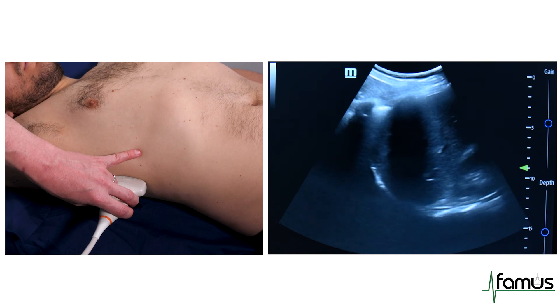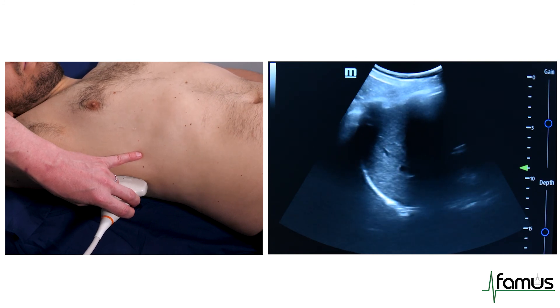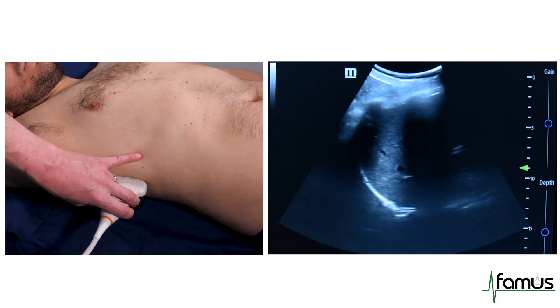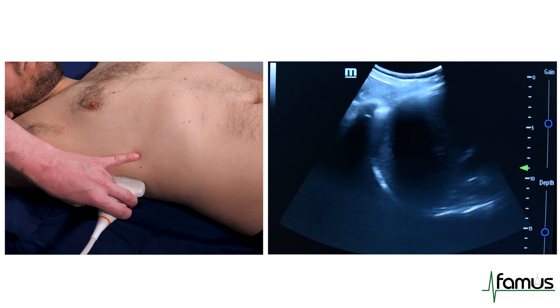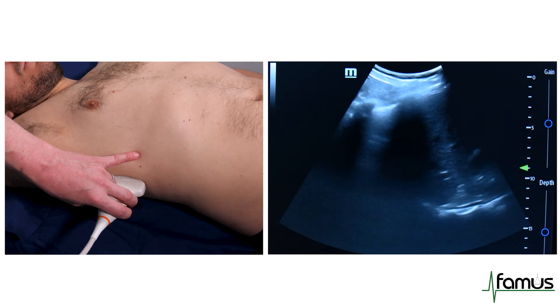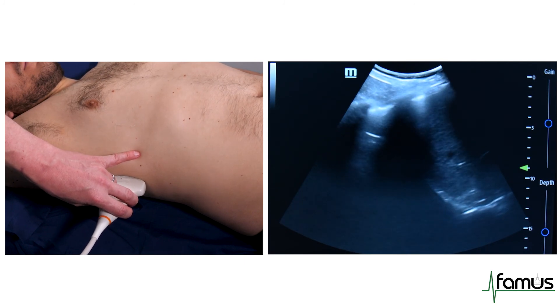Finally, we can see a demonstration of the mirror artefact here, which is generated from the base of the diaphragm as our model breathes out in particular.